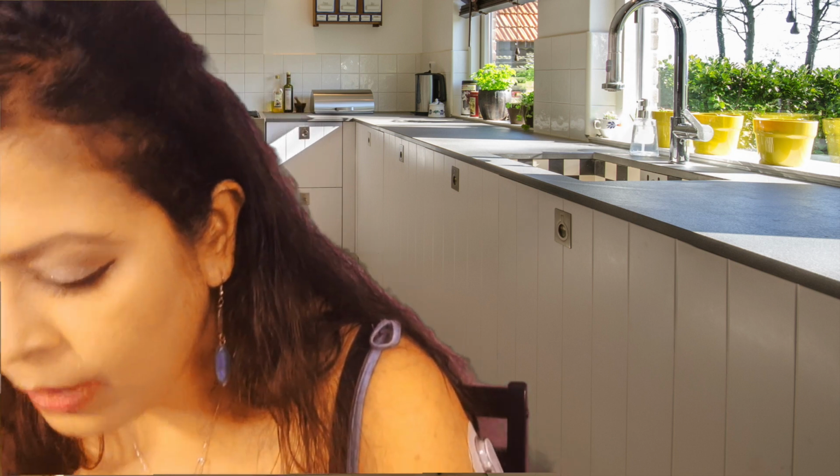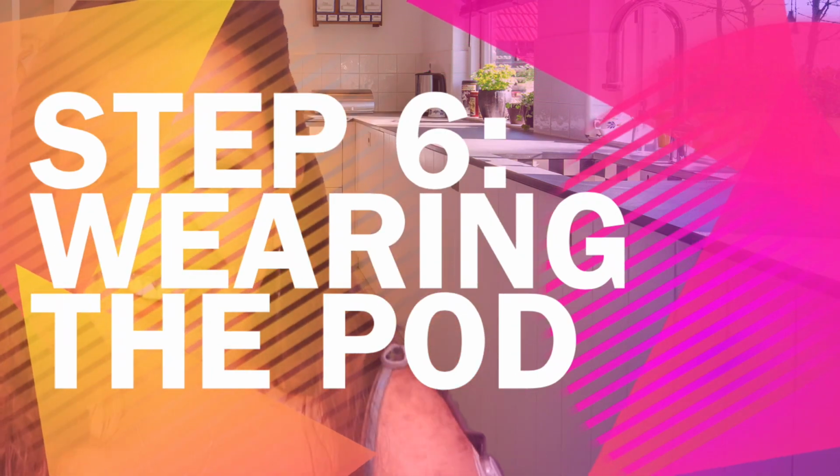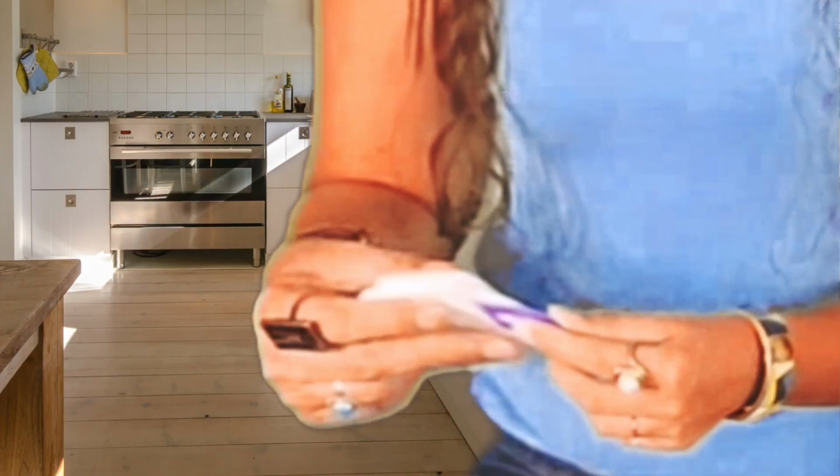Okay, so now my PDM made a sound. Did you guys hear that? Which means that the pod is ready for infusion. So we are going to get started with that step of the process. All right. There is a blue thingy here, so I take that off.